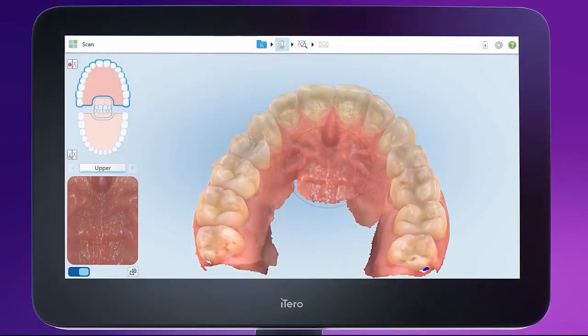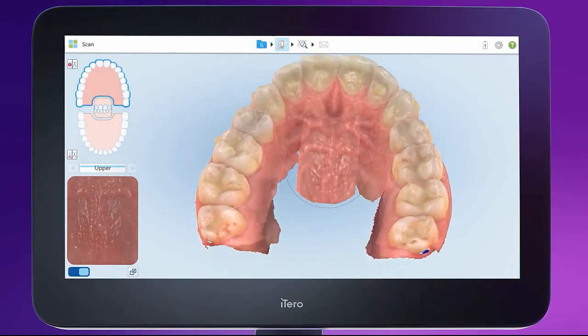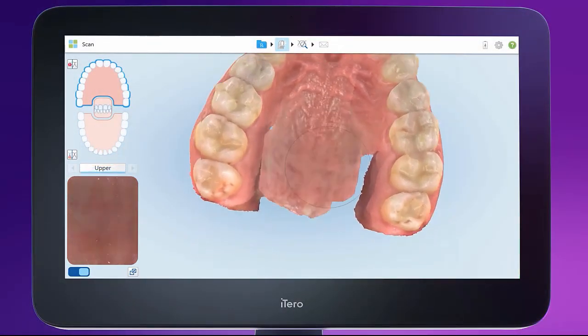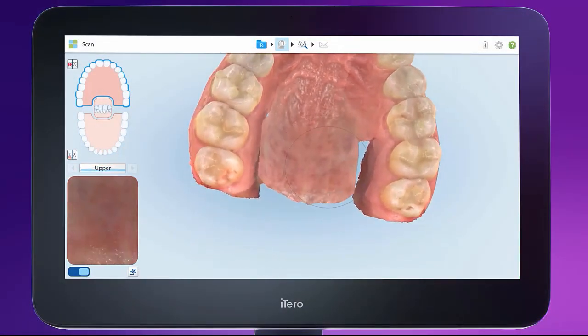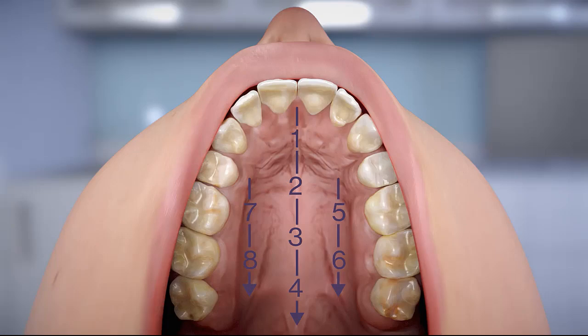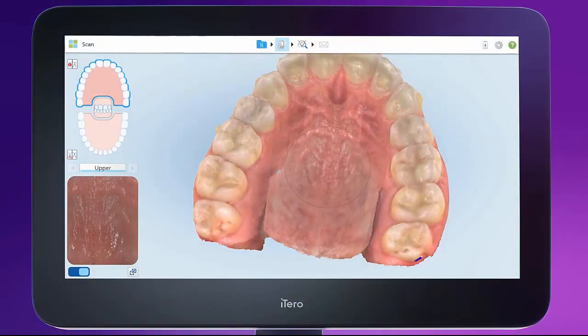First, build the midline, then 2, 3, 4, and then continue building the sides: 5, 6, 7, 8. Do not show too much tooth structure when scanning the palatal segment.